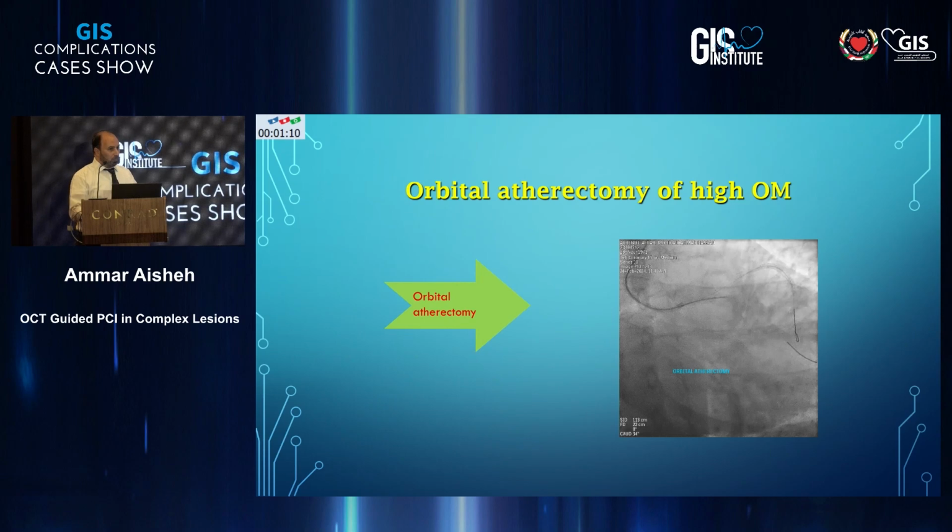Plus, not having a good supportive guide, I would be more worried doing atherectomy and using an atherectomy device with this guide, to be honest with you. So just to clarify, with CSI, where you're doing the ablation is actually 6 millimeters behind the tip of the crown. So it may have worked for you here, but if you have a lesion that you cannot cross, probably a frontal cutting device will be a better option.